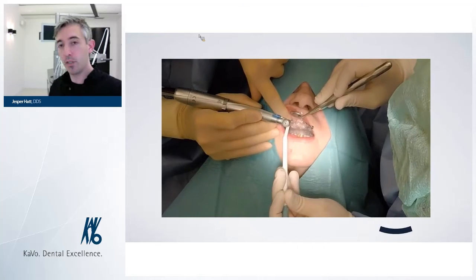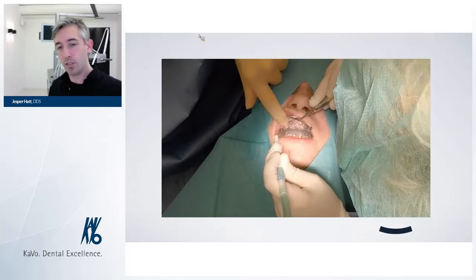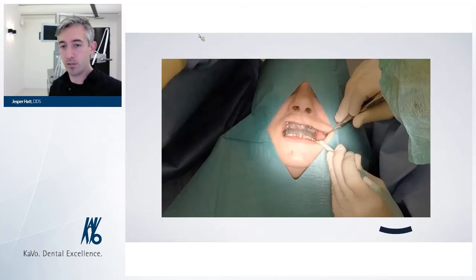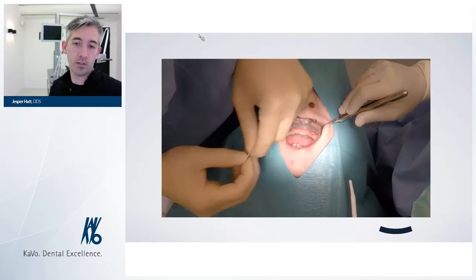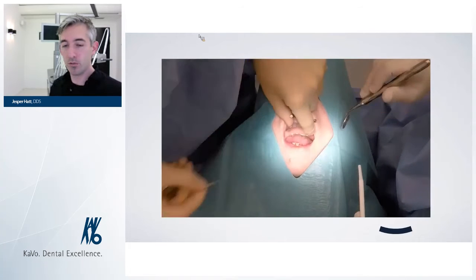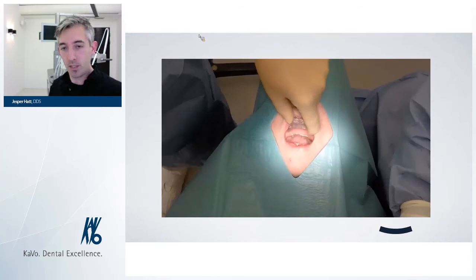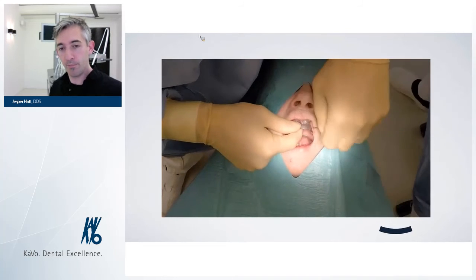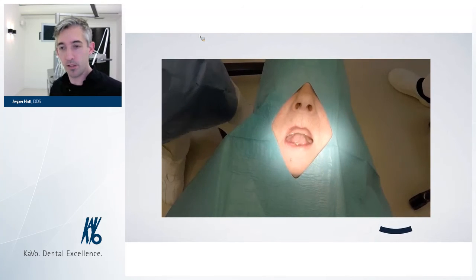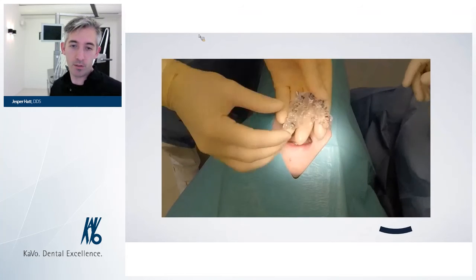Of course, before we did this surgery, we did all our planning, as you saw before, and we scanned the patient and we scanned the scan prosthesis, and we made some corrections just to make it possible to put in this guide. You'll see that in a moment. It looks a little bit different than usual, but it's nothing more than a regular guide. We take out the pins after putting them in, stabilizing the guide, and if the patient, does she feel anything? She didn't. And here you see our upcoming guide with the different colors of the sleeves.